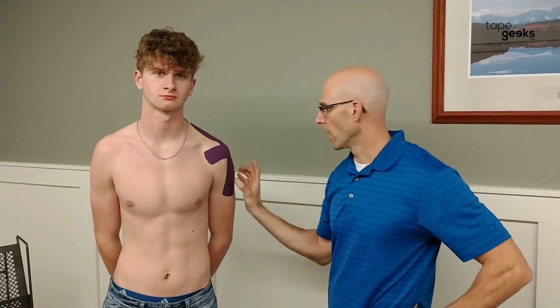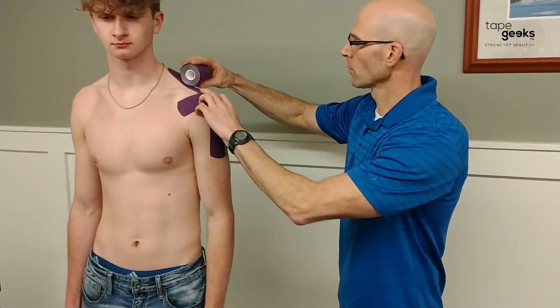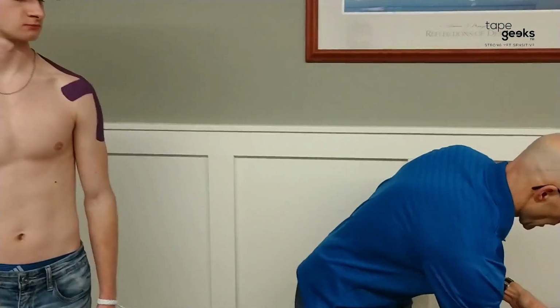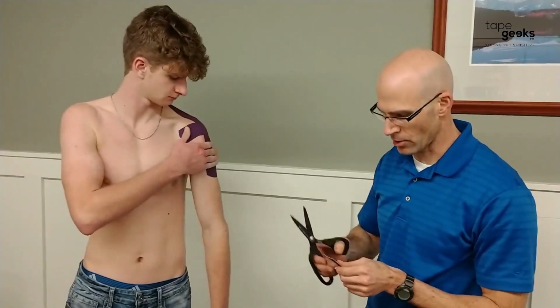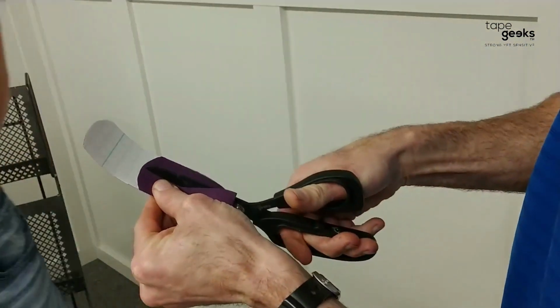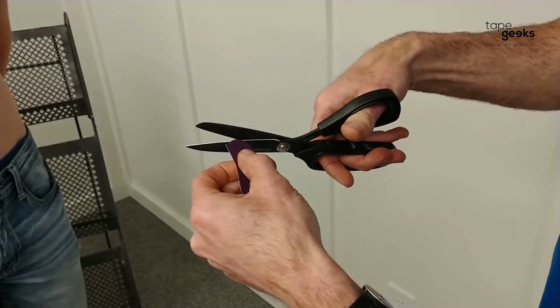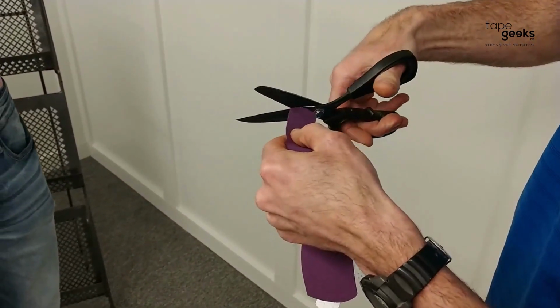So this other tape job that I want to show you is to help also relieve any pain in the shoulder with motion, and it's with the deltoid. I'm going to split the tape into kind of a Y cut. Now remember, when you're measuring, you're going to be pulling on it and making it a little bit longer, so you can bring it back a little bit and not cut it the exact length, because you are going to be stretching it out. Okay, so we're rounding the edges off again, and I'm going to make it a Y cut. Now I want to round these edges still, so they don't get pulled off when you're taking your clothes on and off.